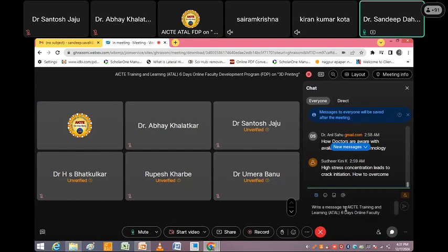I also want to give one example here. Whenever we go with the customized implant, we are using metal 3D printing. But branded companies like Stryker and Johnson produce standard implants in bulk, in masses. So they are not using 3D printers for this type of custom or standard implant. They are using conventional machining. Why? Because they want to manufacture it in bulk. So that is the difference.